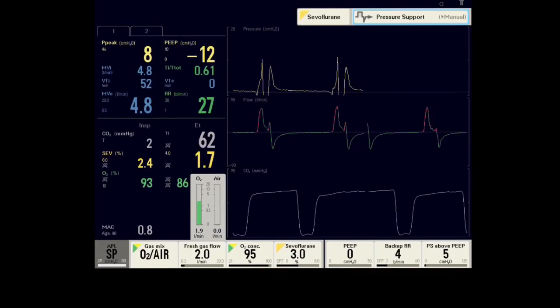Not only do we see the high CO2 and the low inspiratory pressure, we can also look at the waveforms. One is the flow waveform, and in a pressure mode, my flow should always be decelerating. As you notice, my flow starts out during the first part of the inspiration, however, it starts to decelerate, where the patient's still sucking back, and it's going up again.